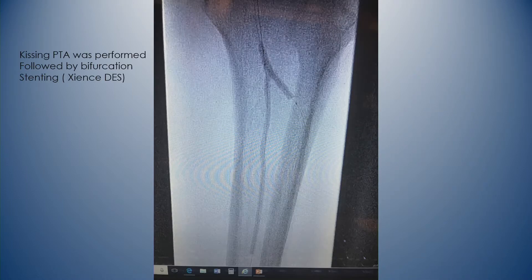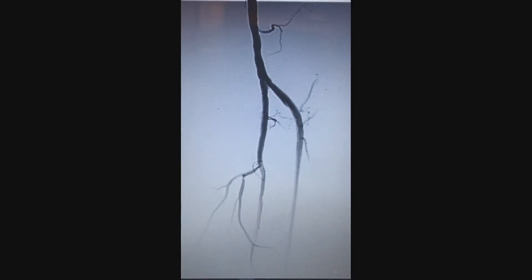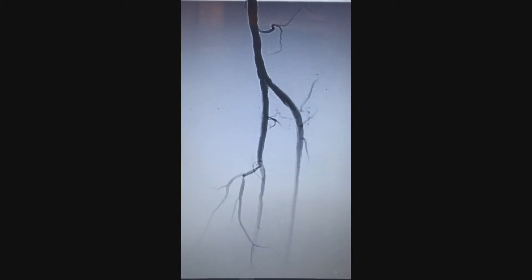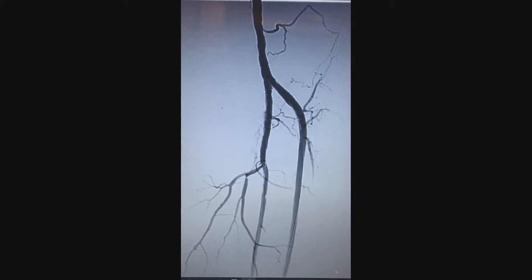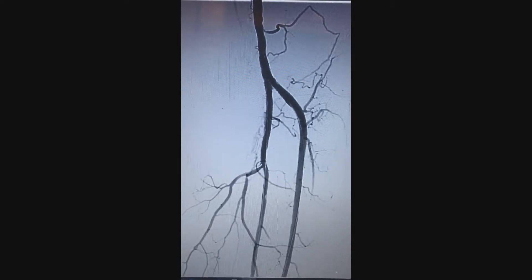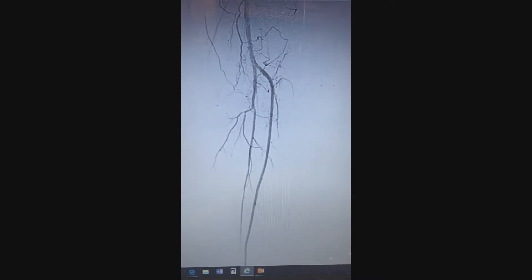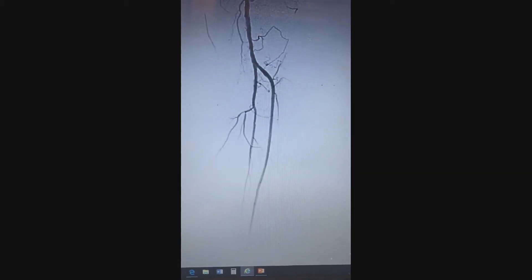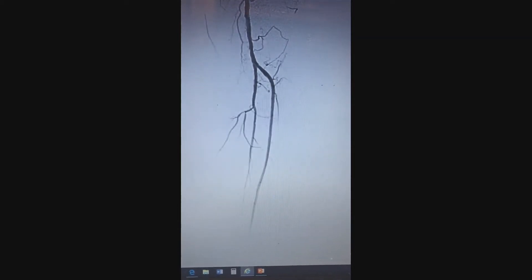And then I moved on to do a kissing balloon, but there was recoil at the bifurcation. So I ended up actually doing a crush stenting bifurcation stenting with two Xience stents, 4-0 and 3-5, and that was the final angiogram. He healed the big toe about almost two months later. He came back about a year and a half later to have an intervention on the right side, and the bifurcation looked very good with the stenting.